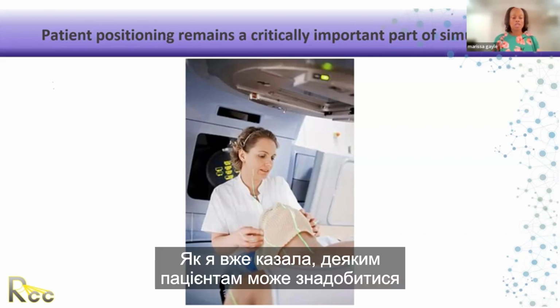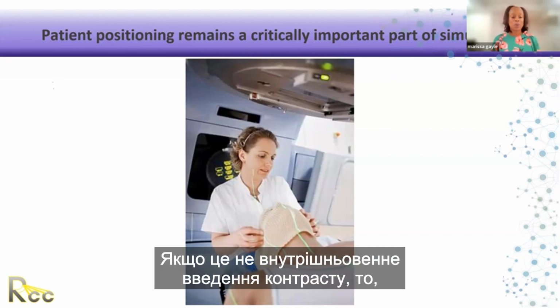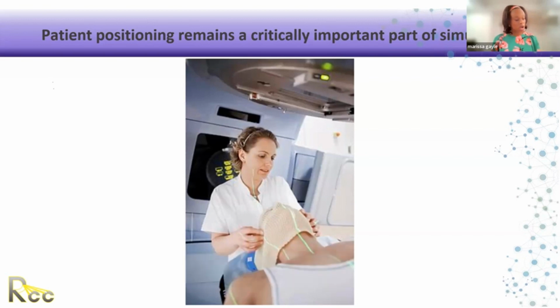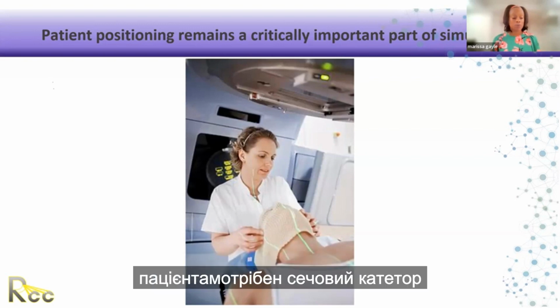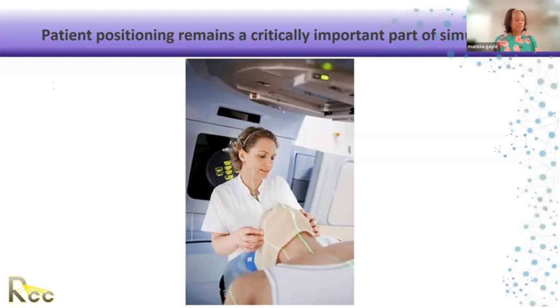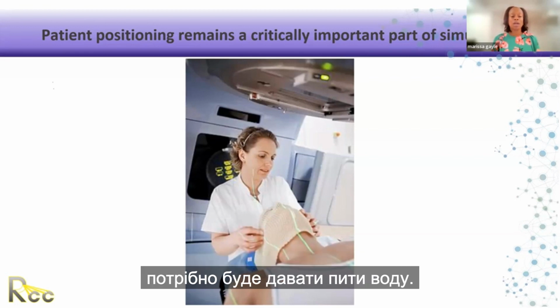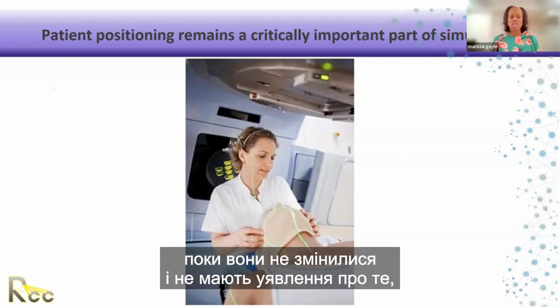Like I said, some patients may have to get IV contrast. We will let them know about that. If it's not IV contrast, it may be oral contrast, so I'll give them the solution to drink. Some patients, like the GYN patients, may need a Foley catheter. And then some of our prostate patients may need to be given water to drink. Whatever it is, I'm going to explain it to them at the beginning before they've changed, so they have an idea of what needs to be done.